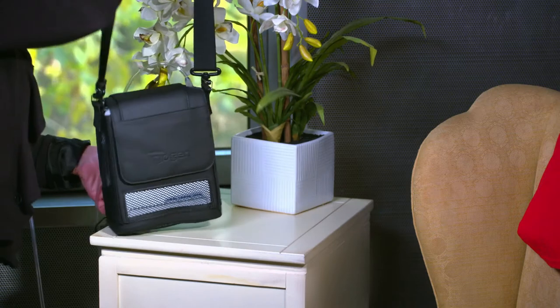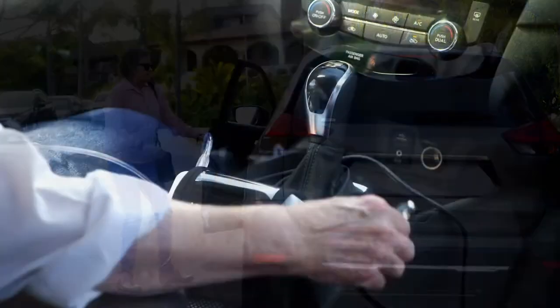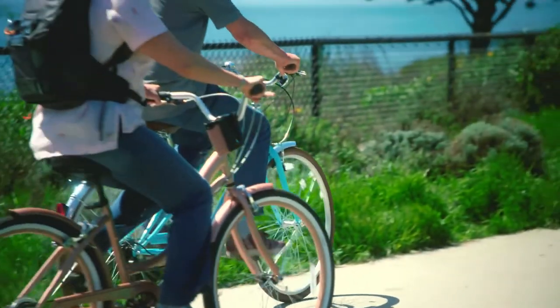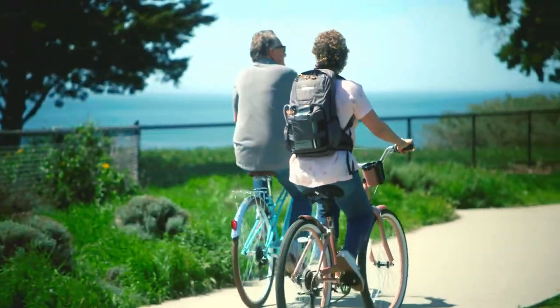You can even leave the Inogen 1 G5 plugged in all night with a battery attached. And when you wake up, you'll have a full charge to start the day. If you get into the car to run an errand, you can plug into the car's power by using the G5 DC power cable provided with your system. If you'll be gone for the entire day or overnight, you'll want to bring extra batteries and your AC power supply.